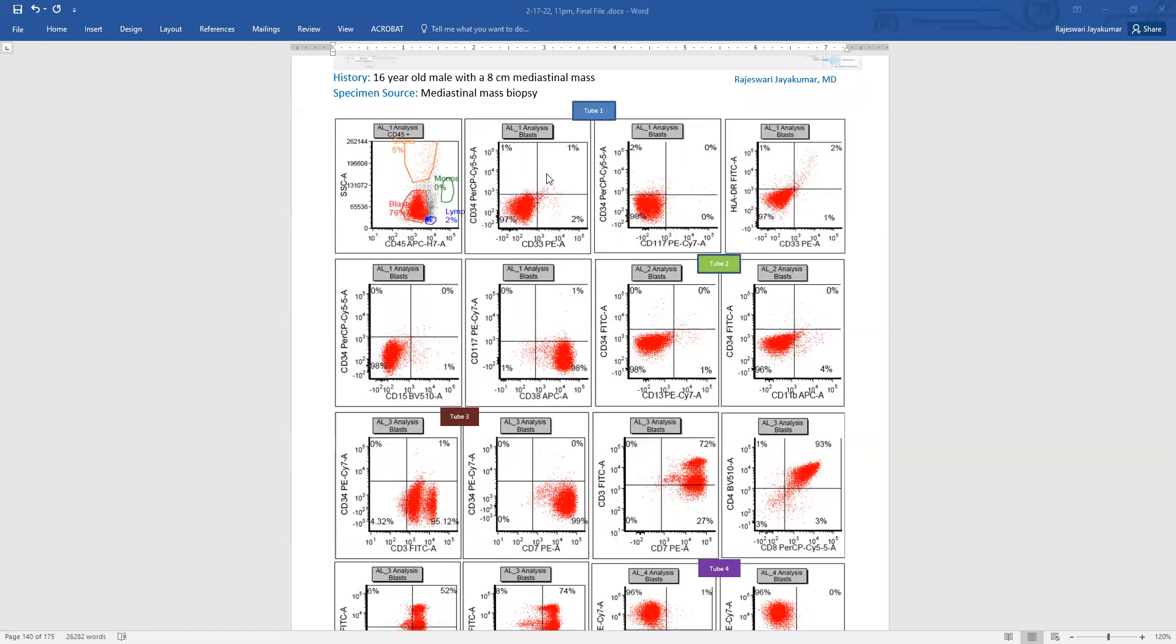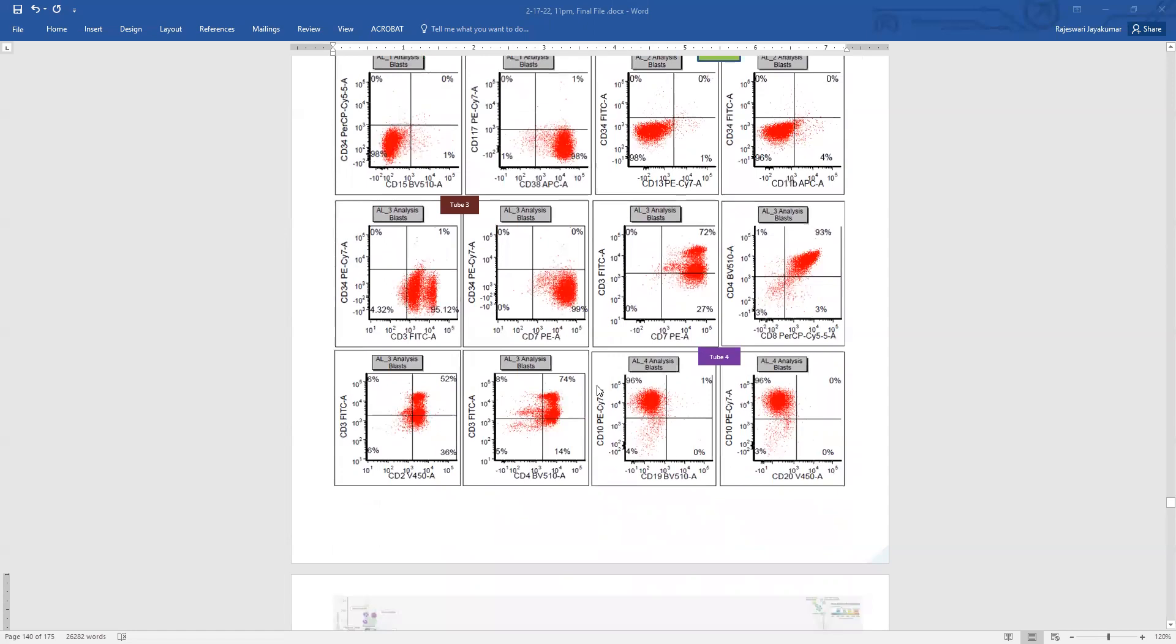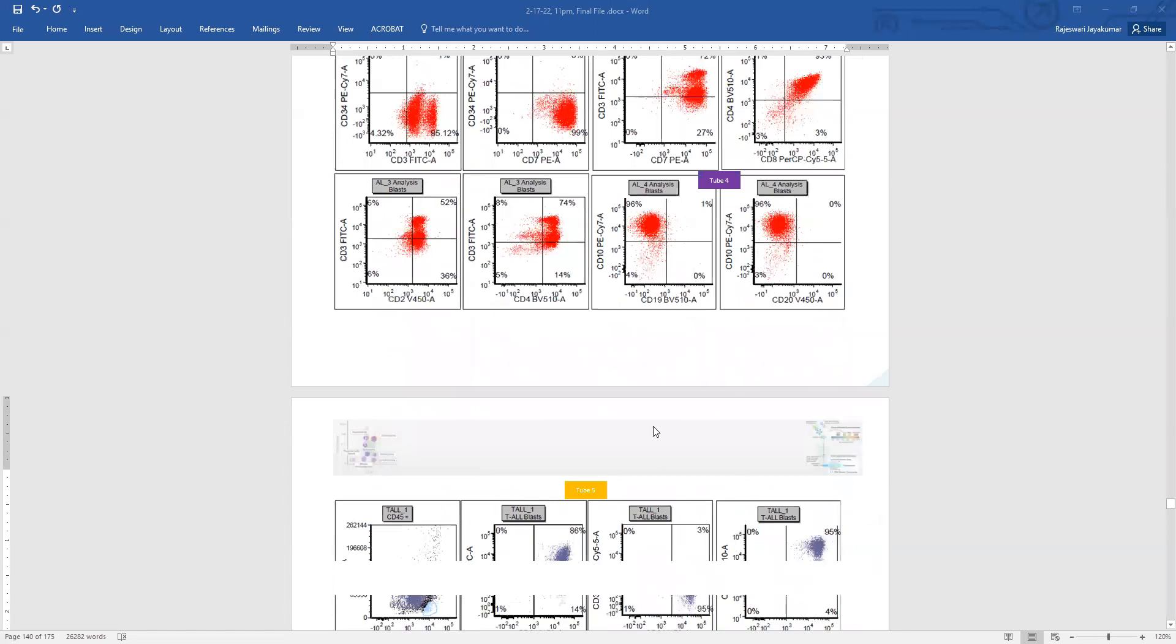We don't have CD34 expression. And those cells are sitting on the blast gate, but we don't have CD34 expression. We do not have HLA-DR expression. And also we should know that the thing that we can see in mediastinum includes both thymus and lymphoma. So we need to have an immaturity marker to call it lymphoma. So these cells are 4 and 8 double positive, although T cell precursors are the blasts. Our immature cells can express both 4 and 8. That alone is not enough to call it lymphoblasts because thymus will also have some double positive population. So we'll see how we can differentiate the two. But CD10 can be considered as an immaturity marker. Let's see more.